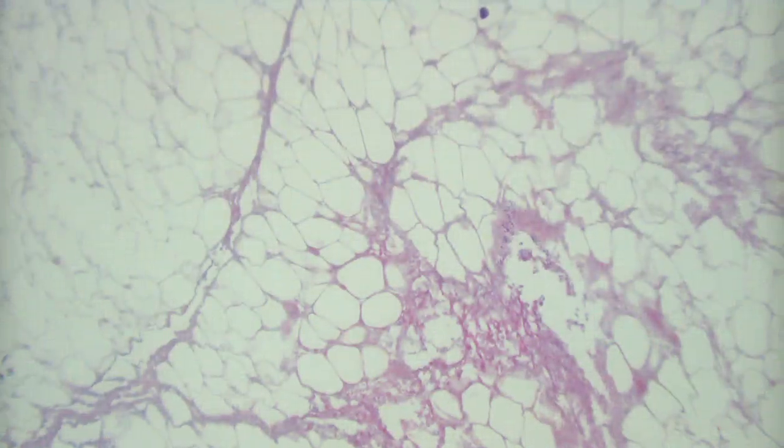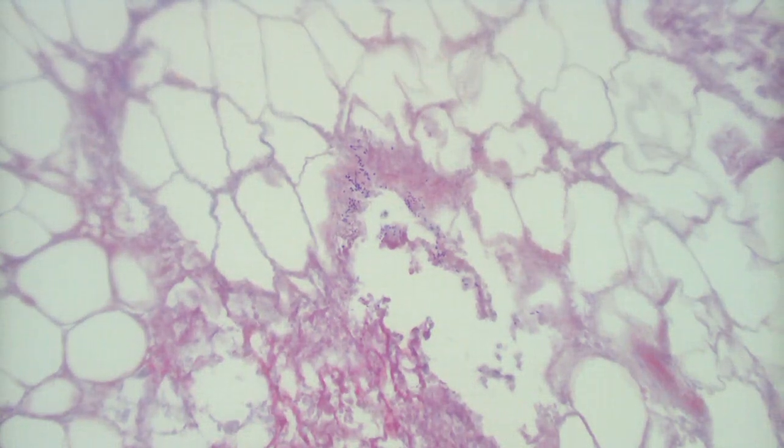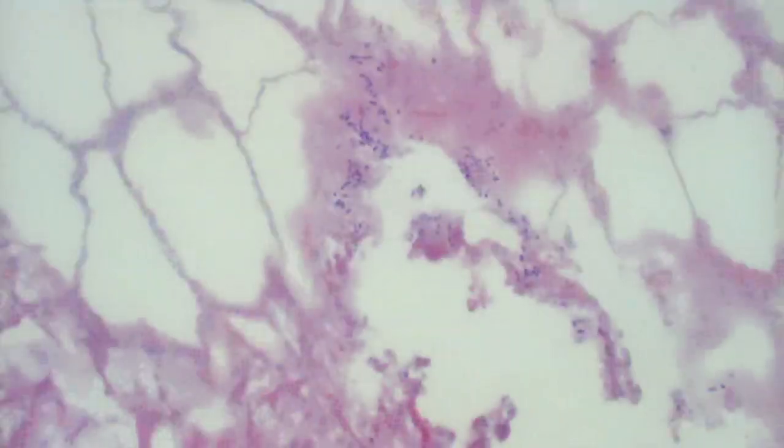Okay, and you said infectious. Which infection were you thinking about here? A bacterial infection. Okay, which one? It's neutrophilic. It could be staph or strep, common things. There probably are some bacteria sitting in here, it looks like.